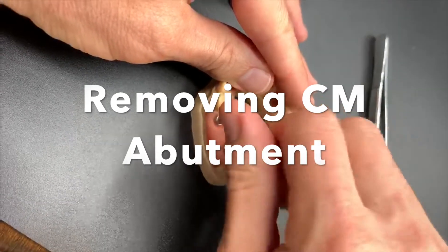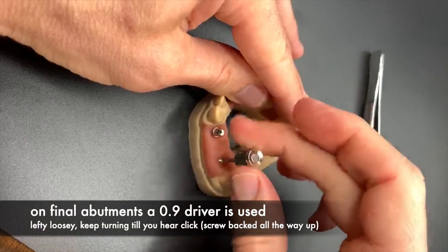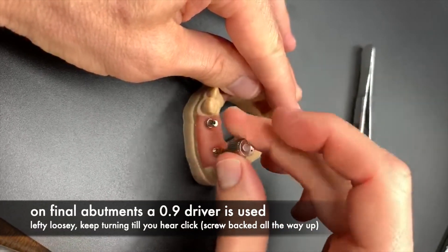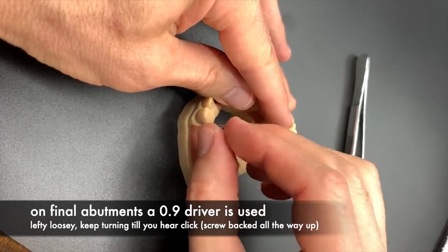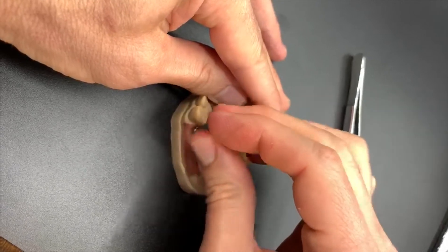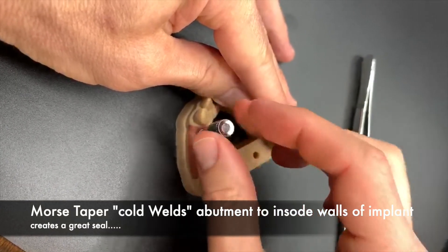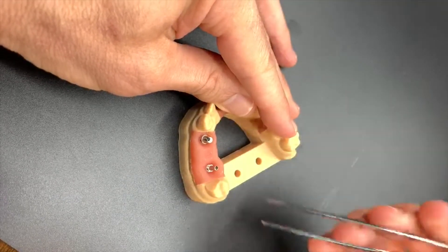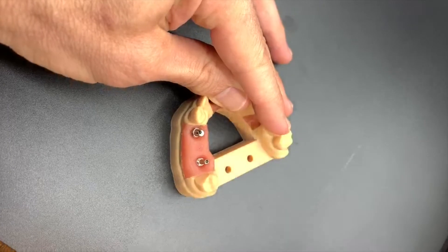Removing a CM or Cone Morse abutment. You can see that we're going lefty-loosey, loosening the screw — the captured screw that's inside the abutment. The screws don't come out. We have a 0.9 hex screwdriver; it's a small hex. We're going lefty-loosey because the abutments have this cold weld where they lock into the inside of the implant.